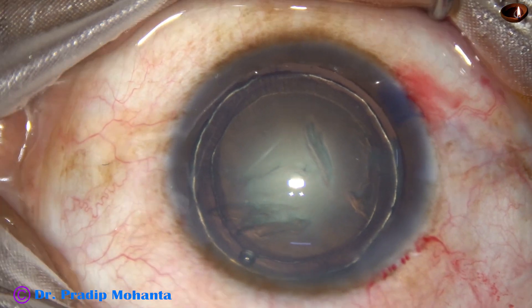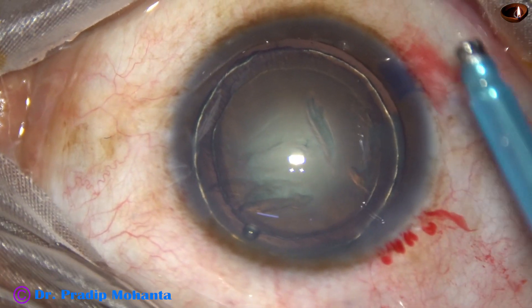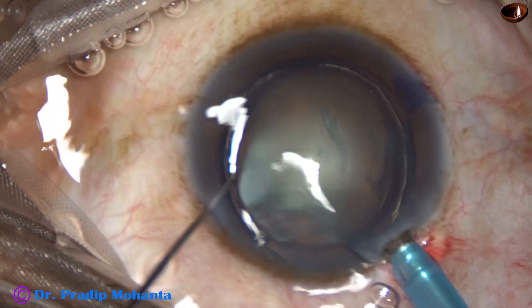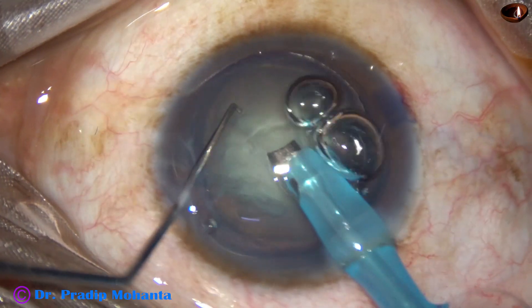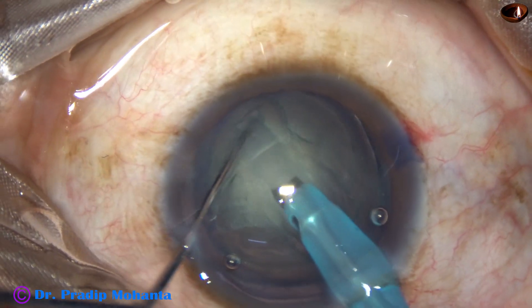Let us see the stop and chop technique of phacoemulsification. This is the sculpt mode where the vacuum is about 50 mmHg, flow rate is 20, and ultrasonic energy is according to the hardness of the nucleus. In this case, it is only 50%.